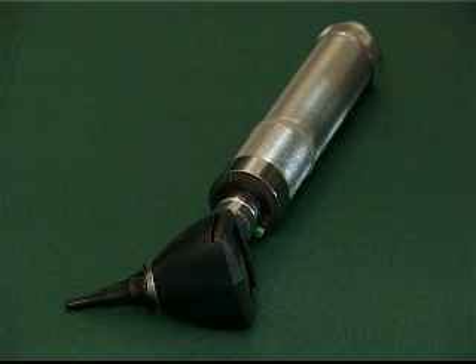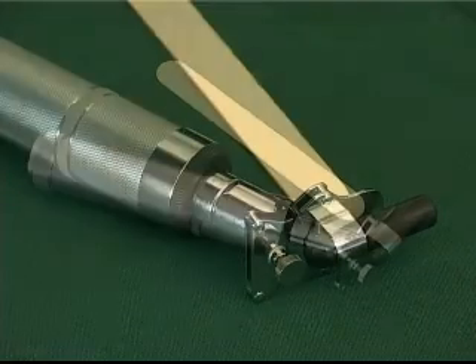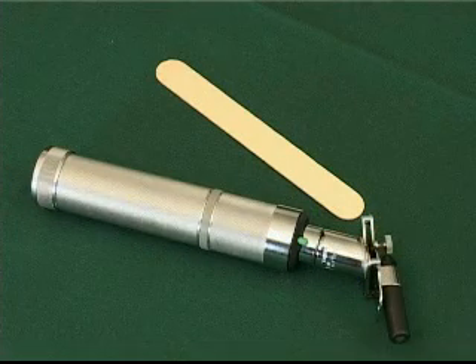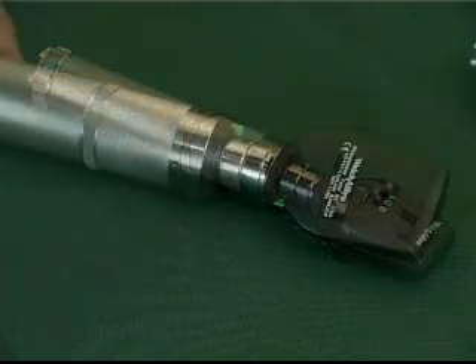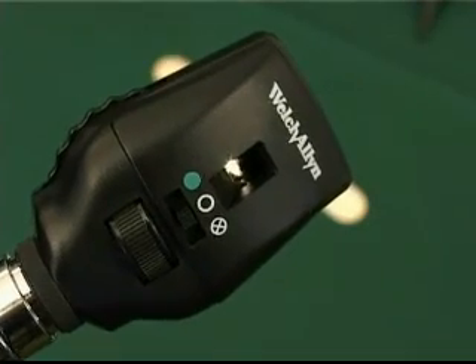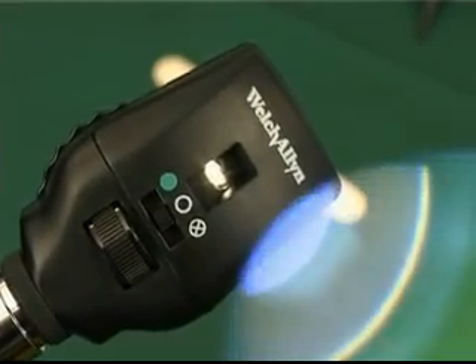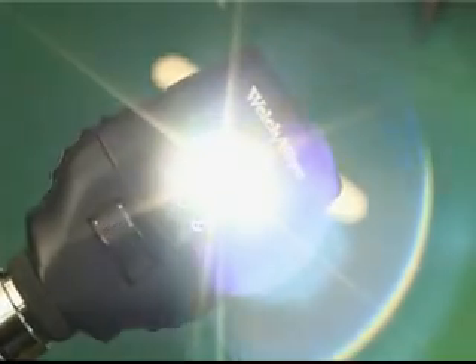The otoscope is used to examine the ear canal, typically if a patient is complaining of earache or deafness. The tongue blade holder is used for the examination of the throat in cases where the patient complains of a sore throat or hoarseness. The ophthalmoscope would typically be used by a doctor to examine the back of the eye, known as the fundus, using the pupil for access to ascertain the extent of lesions, growths, and also to examine the blood vessels for any abnormalities.